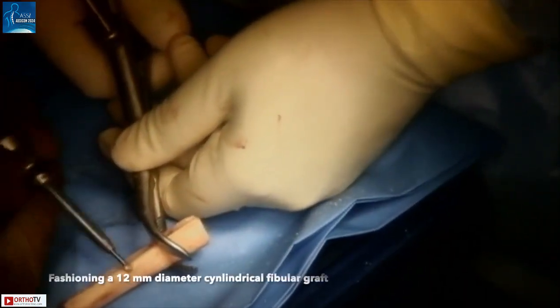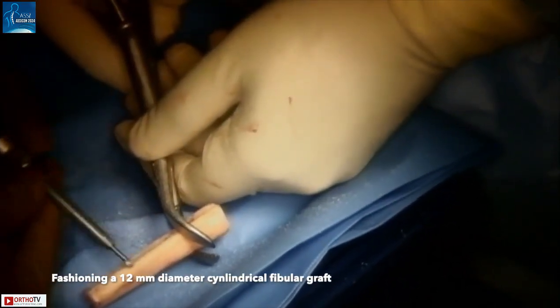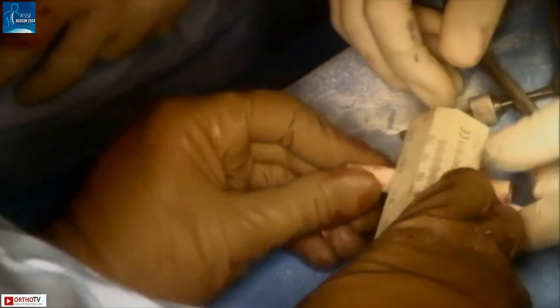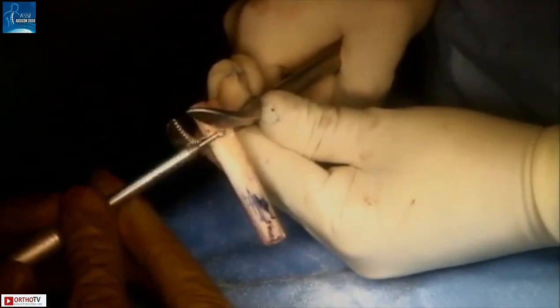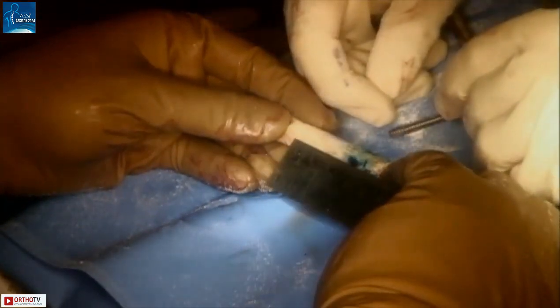Approximately 7 cm of fibula has already been harvested by a colleague. We then proceed to give a cylindrical shape to the fibula — an ACL sizer is quite useful for doing this. Methylene blue is coated on the inner surface of the 12 mm ACL sizer; when the fibula is inserted through this sizer, parts of the fibula that need trimming are stained blue. Availability of adequate length of fibula is confirmed before proceeding.